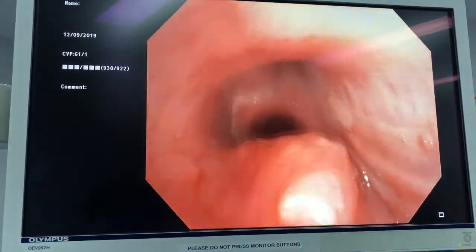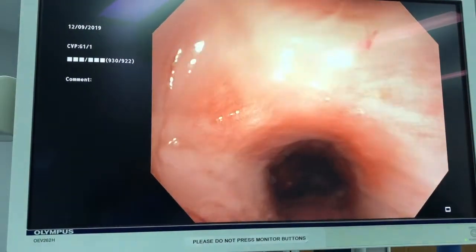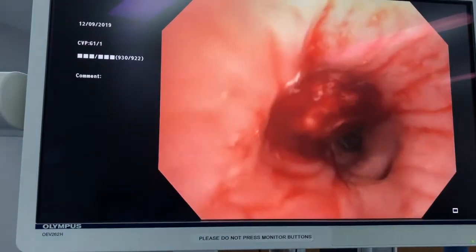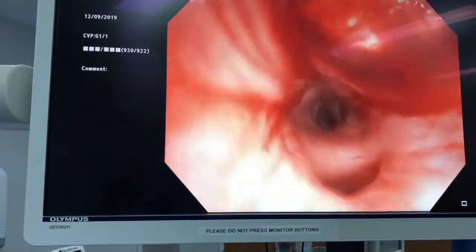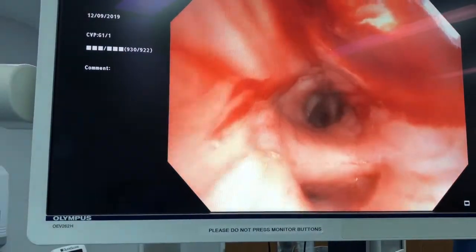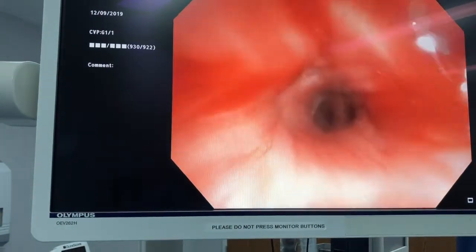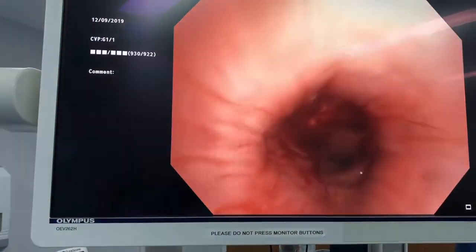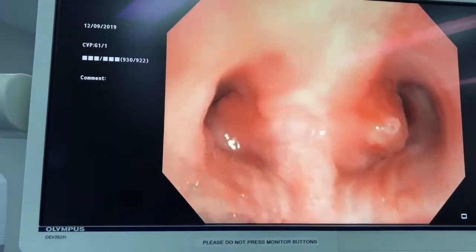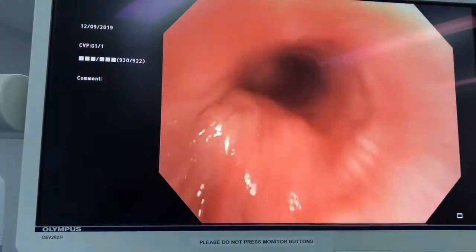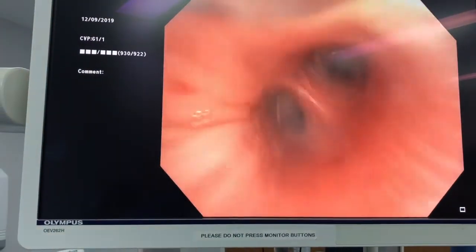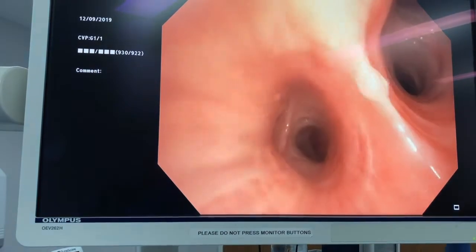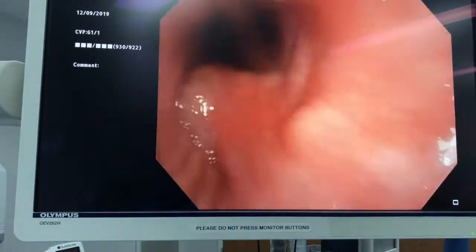Let's go and have a look now. There's the abnormality in the right main bronchus. If you look down in the bronchus intermedius there, we can still see tumour blocking off the right middle lobe, but the right lower lobe is now completely patent. So that won't block off now, and that will allow airflow to the lower lobe, which will improve this patient's breathing significantly. Let's have a look into the left lung, just to make sure it's okay — left upper lobe and left lower lobe are all patent.